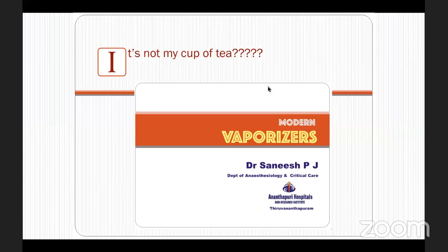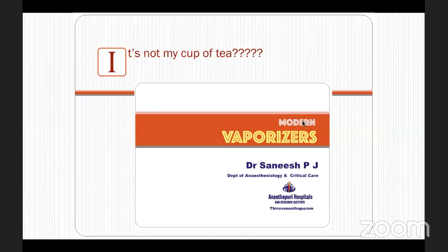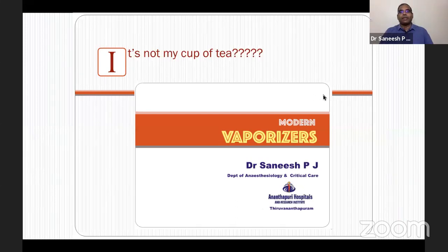Sir, only one thing about filling of vaporizers while they are in use. For other vaporizers also, can we fill them when they are in use, right? No, manufacturers are not advocating it. Only for desflurane is there a specific instruction that you need not turn the vaporizer off. So it's a good practice to turn the vaporizer off and fill.